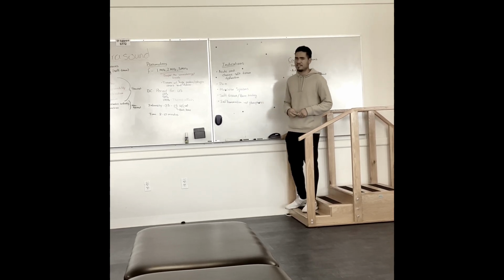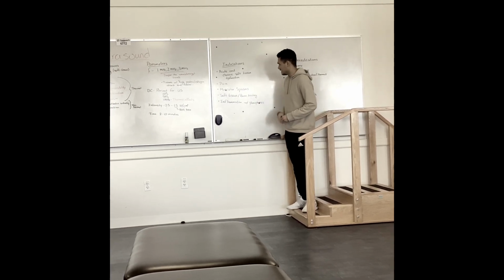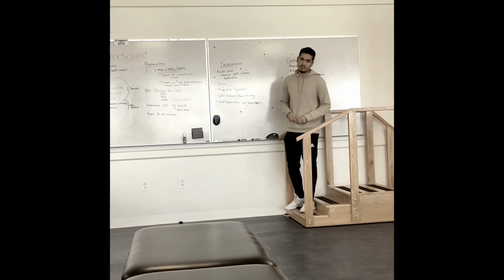That's an indication for most modalities. Another one is muscular spasms. As we know, it can help with muscular spasms, especially with thermal. It can help with soft tissue and bone healing. And then it can even help with inflammation using phonophoresis.